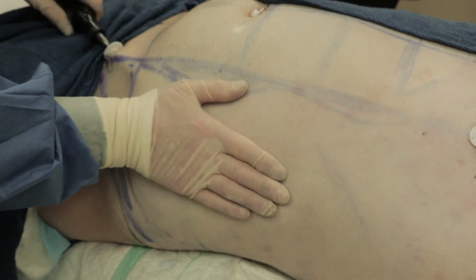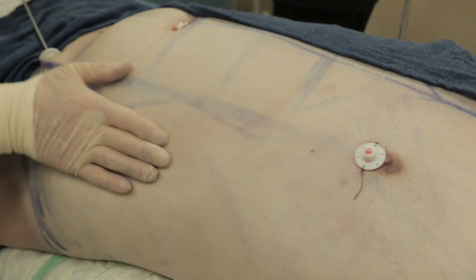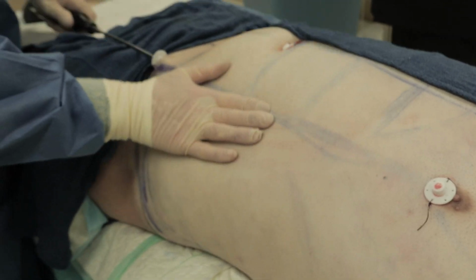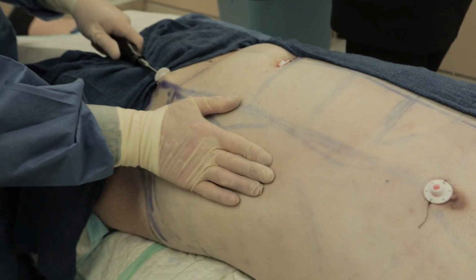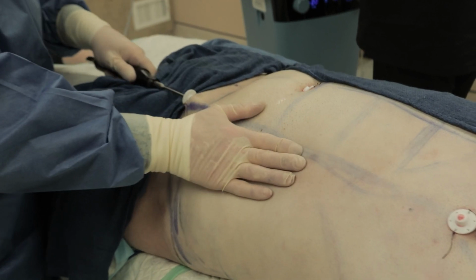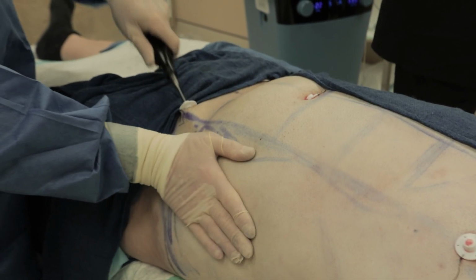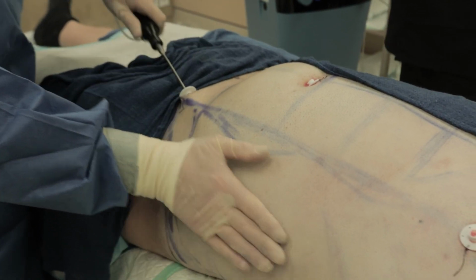It melts the fat and melts the glands when I did the chest, and had some heat there, so it's kind of off-label, if I can say it. I don't mind saying it, but it heats up the skin, has some skin tightening properties to it also. So we're using my smart hand to feel, and then going all the way around. At first when I started, it had some resistance. Now it's like butter, like Philadelphia cream cheese.